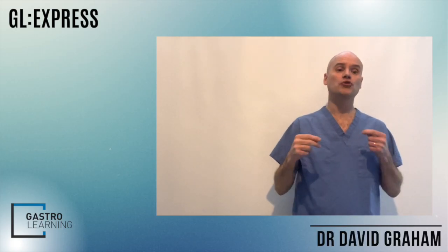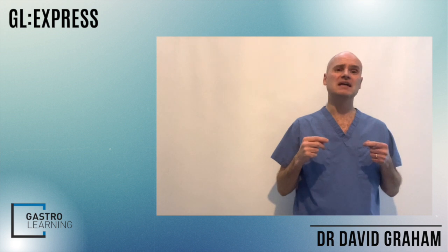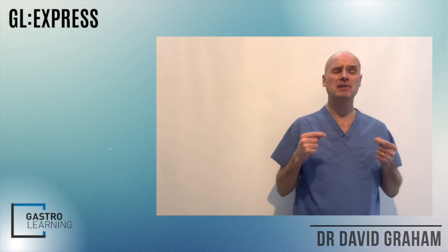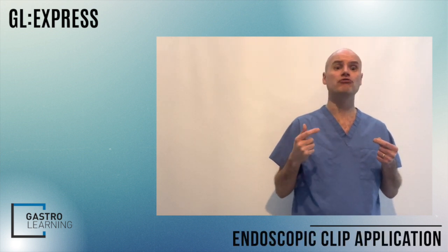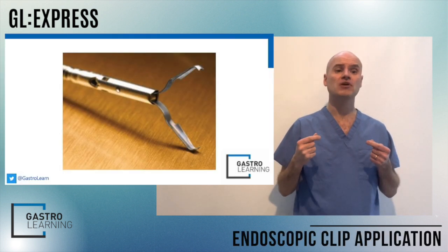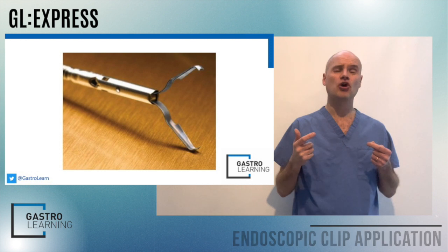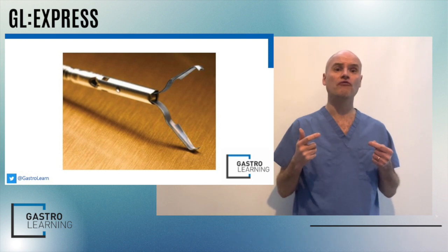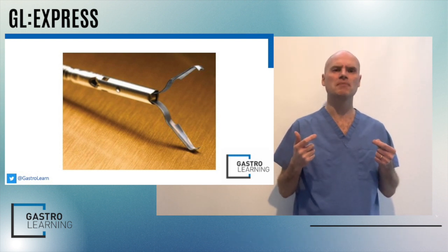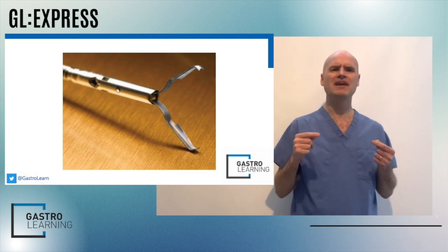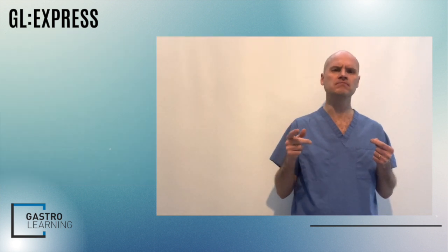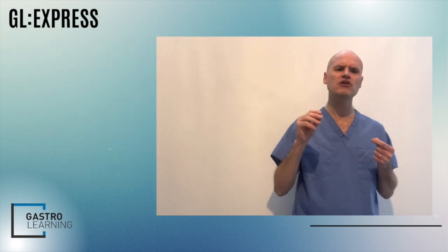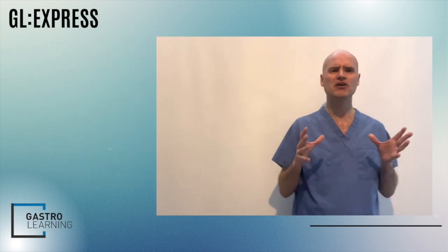What I want to talk about is the application of endoscopic through-the-scope clips, particularly in the context of non-variceal peptic ulcer GI bleeds, and specifically when and how to apply a clip.